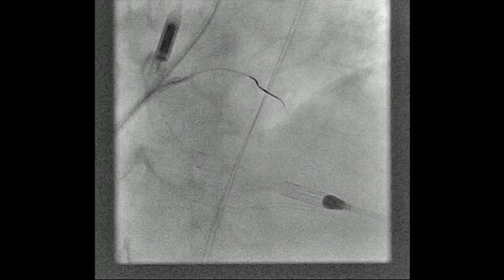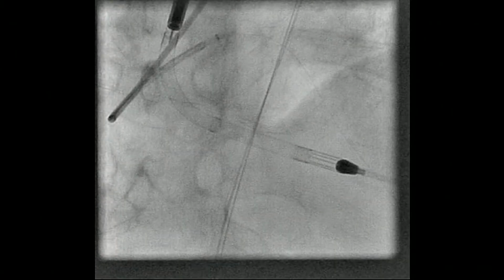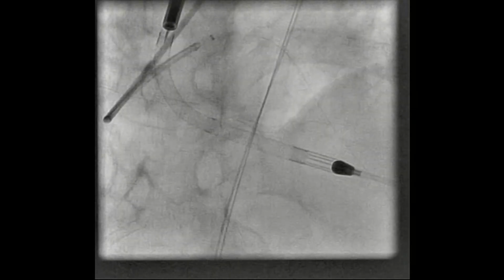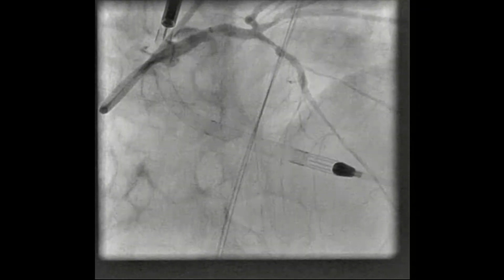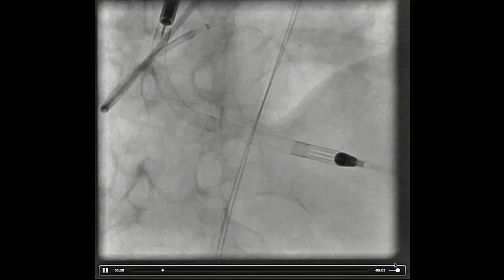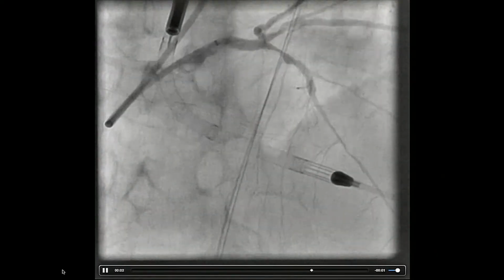And you're using a guide liner as well, so I see. Mohamed, did you use the Turnpike LP straight away, or did you try the gold before? No, I just used Turnpike LP. That's the one we have. We've had good experience with it. We like it a lot.